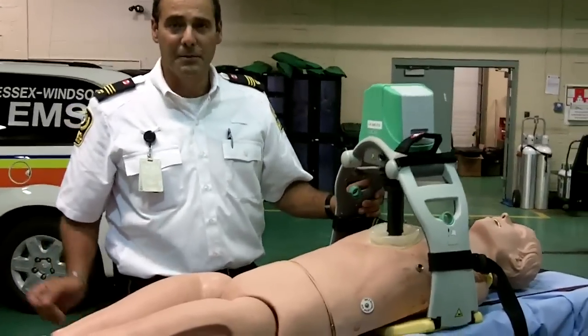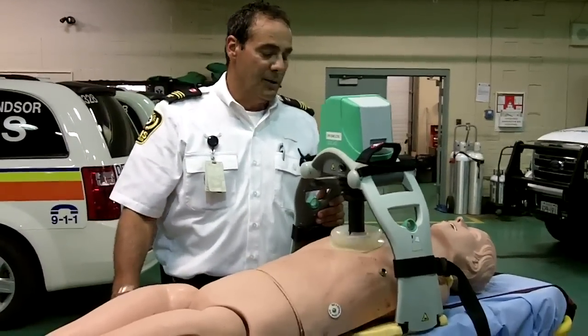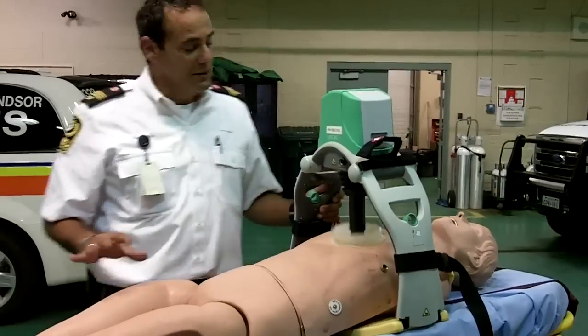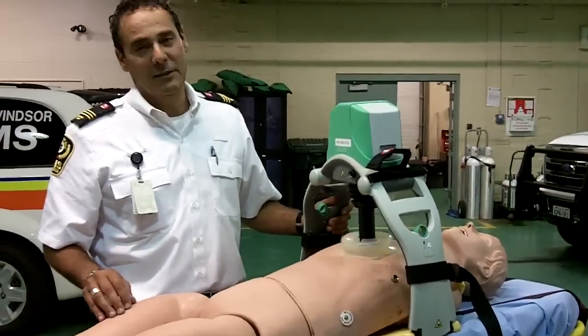Now we get perfect compressions of 30 to 2. The great thing about this machine is that the compressions are always one and a half to two inches deep, and you're perfect every time.